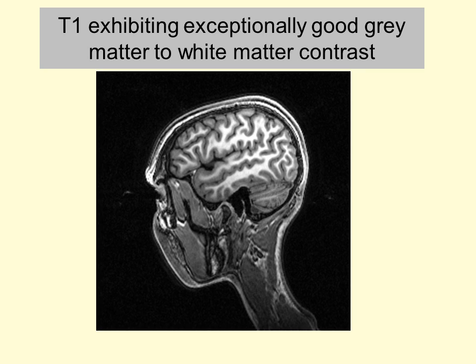You've probably seen some journal articles where they publish flat maps of the brain instead of brains as we're used to seeing them, because of course with a flat map they've unfolded all the gyri and sulci, and you can see much better in those valleys and fissures. And if they've done their research thoroughly, then they've probably begun with a sequence like this one in the scanner and paid the cost in time to get these high quality images.